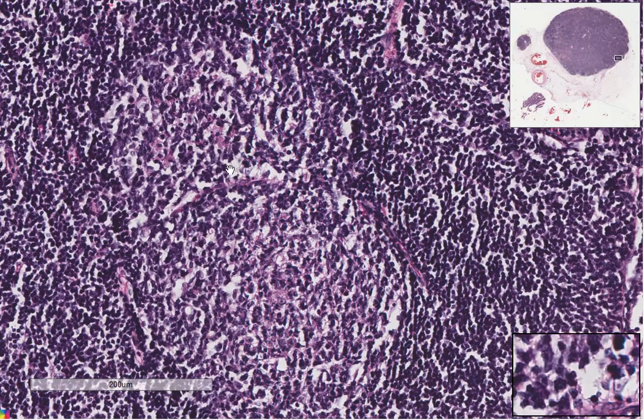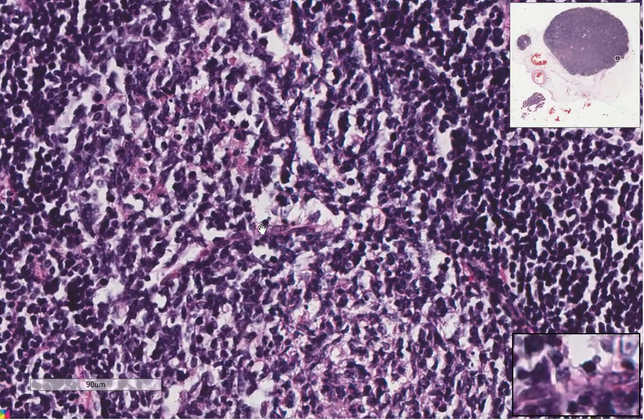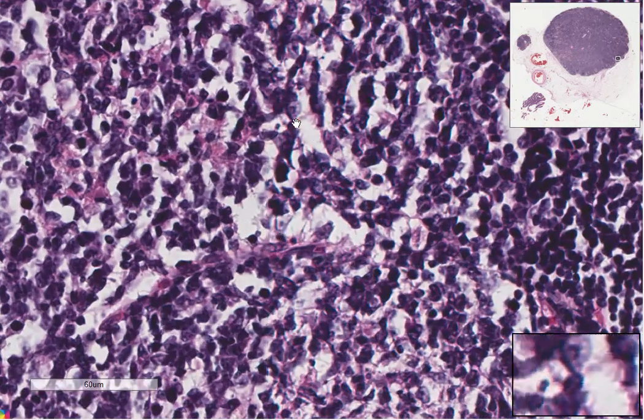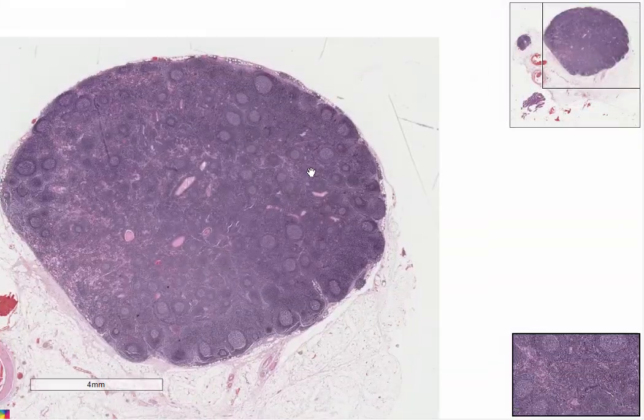So as you can see, they are larger cells with very clear cytoplasm, and sometimes you may see apoptotic bodies within here. Like you can see here, here's an apoptotic body, that small fragment. Probably this is a tingible body macrophage. Let me show you another one.